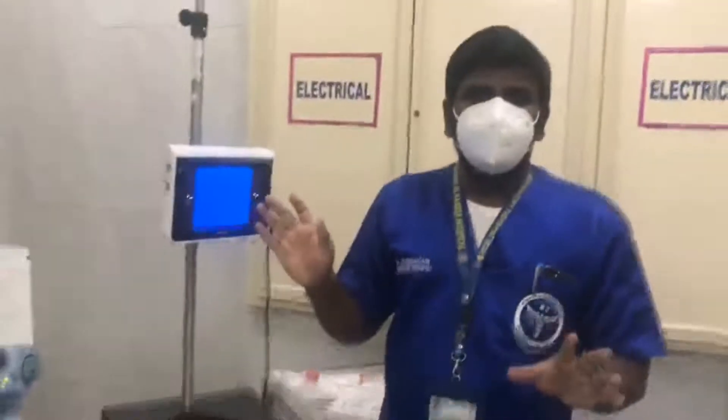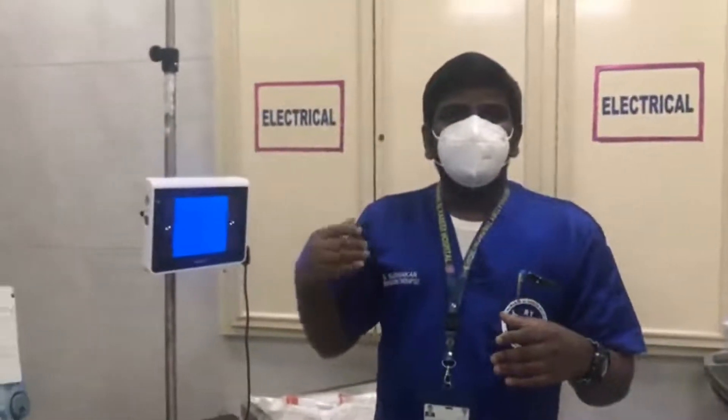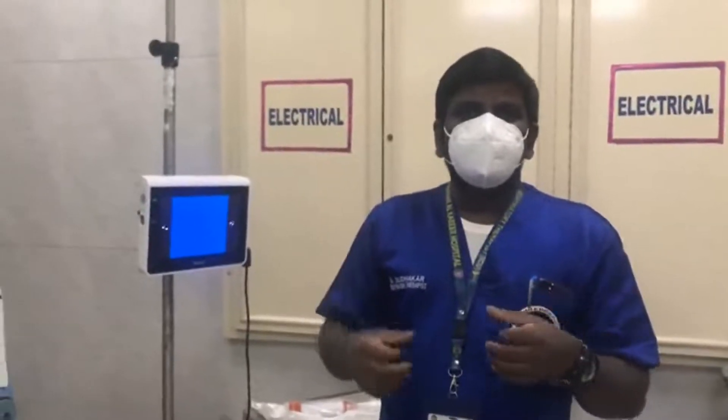I will teach you later how to connect the scopes. The common indication we are using the AMBU disposable scope is mainly for severe COVID pneumonia and severe infection cases, so there is no need to expose the reusable one.